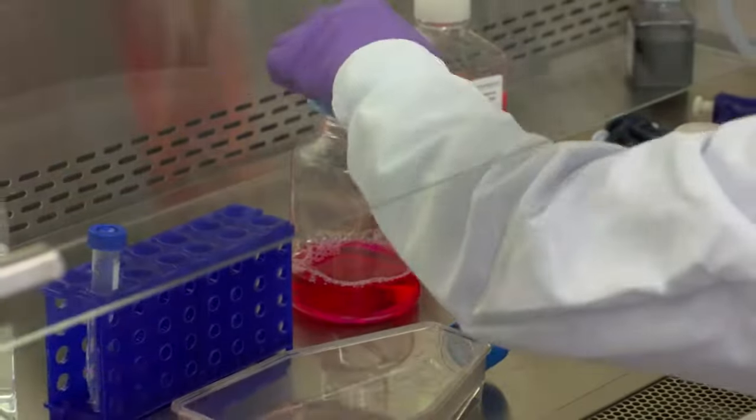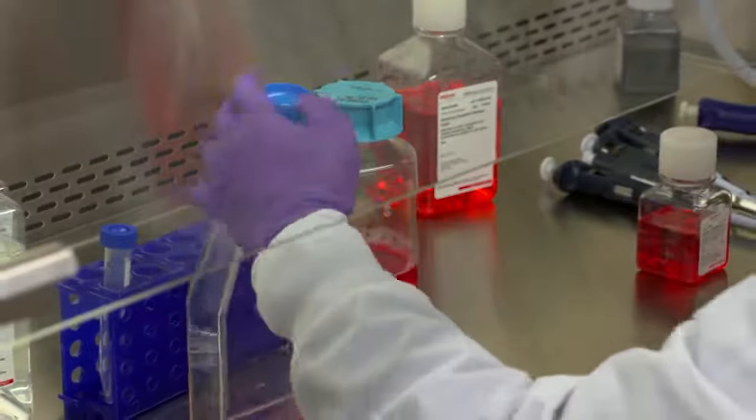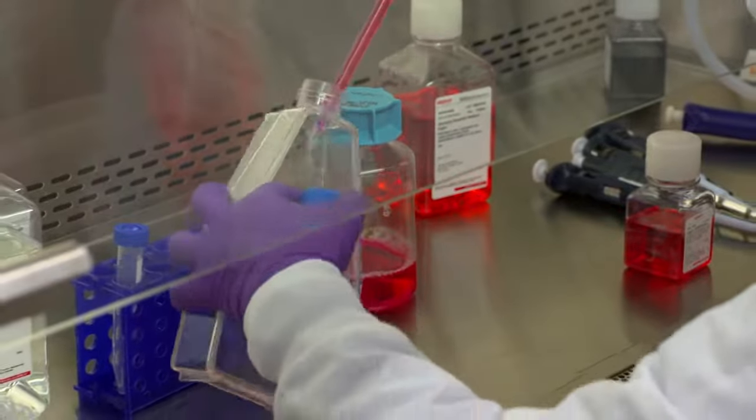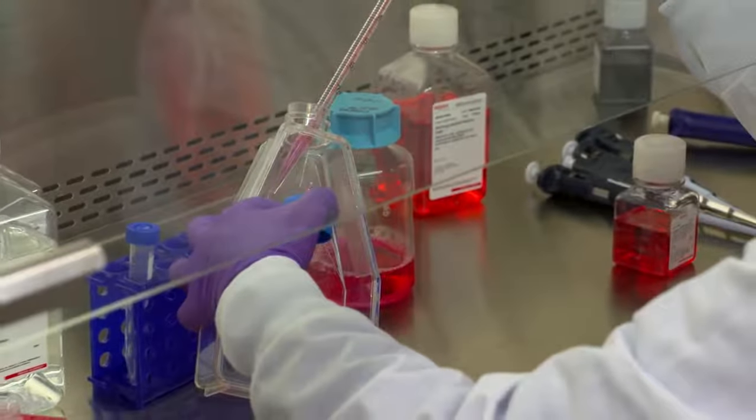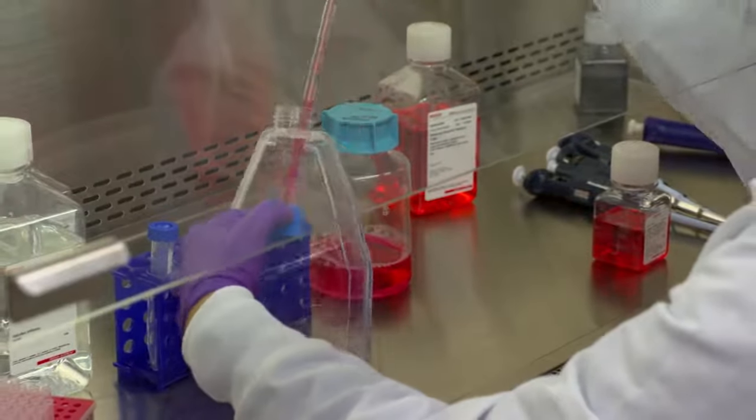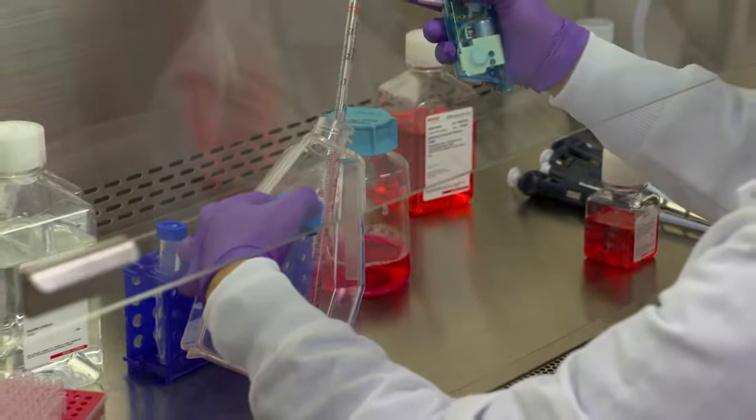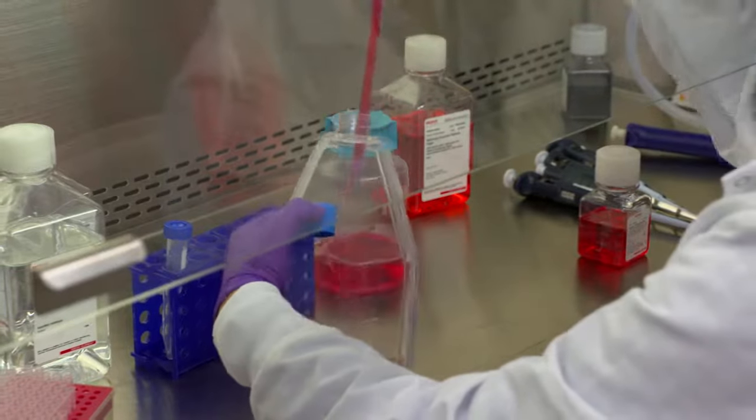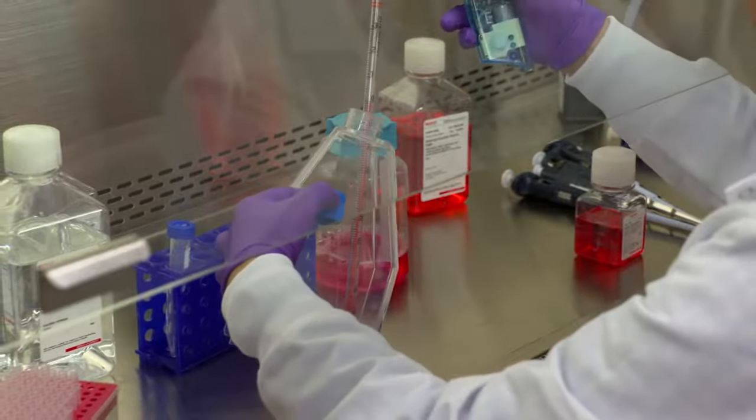When greater than 90 percent of cells are detached, put the flask in standing position and neutralize the dissociation reagent with serum containing medium appropriate to the cell line in culture. Usually 1x trypsin volume equivalent is sufficient to neutralize trypsin.